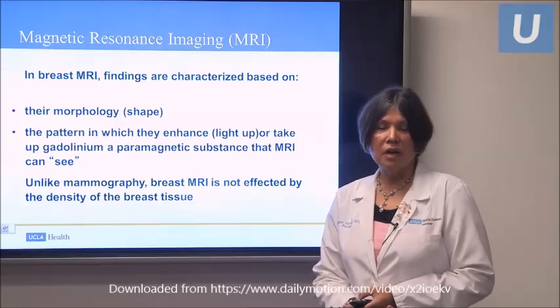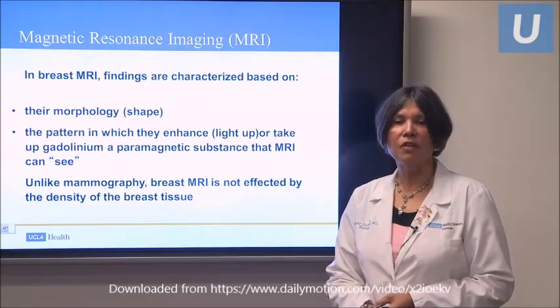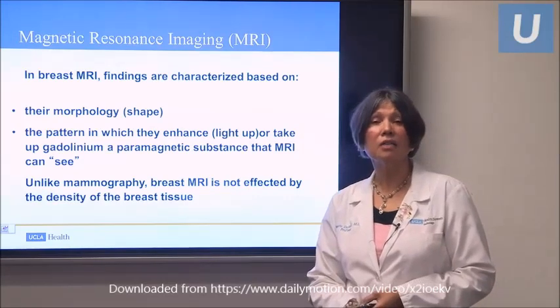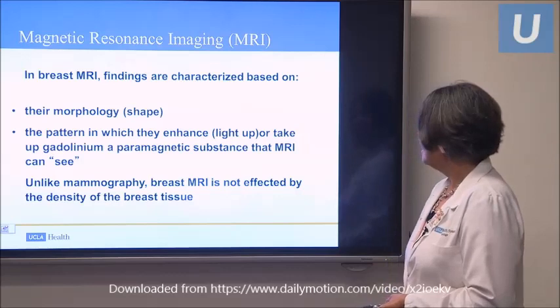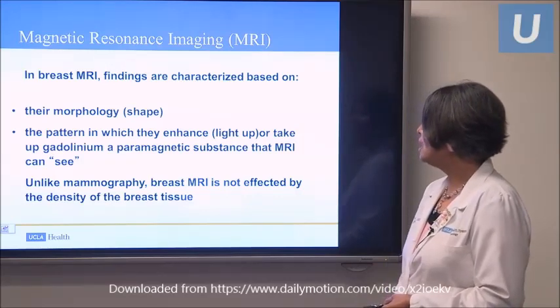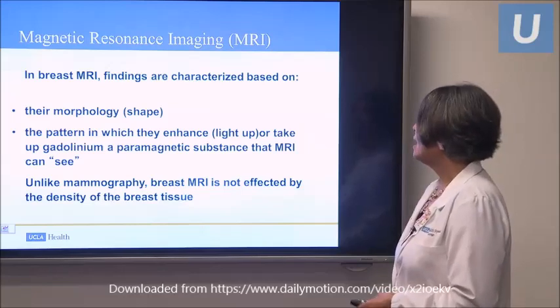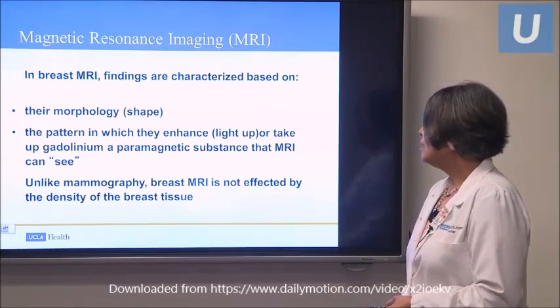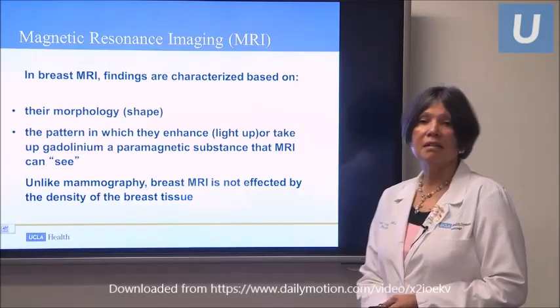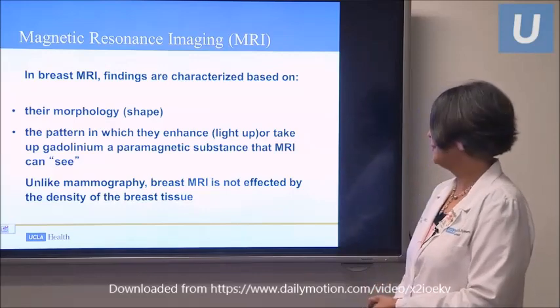We still try to let everyone know that there can be allergic reactions, so just let us know if you've ever had any kind of reaction to any kind of contrast. We take pictures before we give the gadolinium and after, and it will actually light up comparatively. Unlike mammography, breast MRI is not affected by the density of the breast.